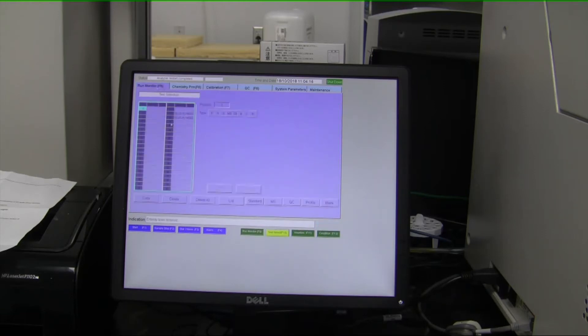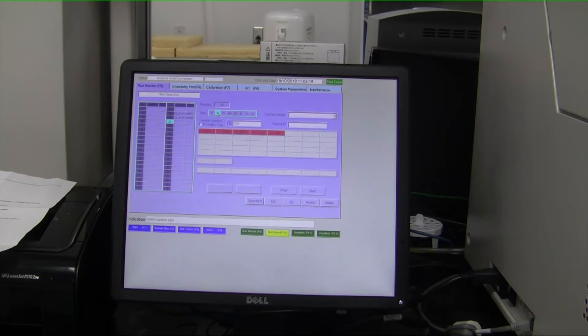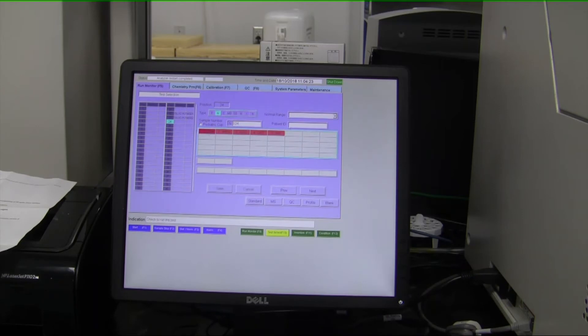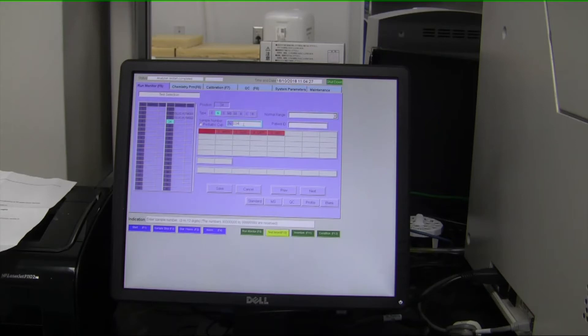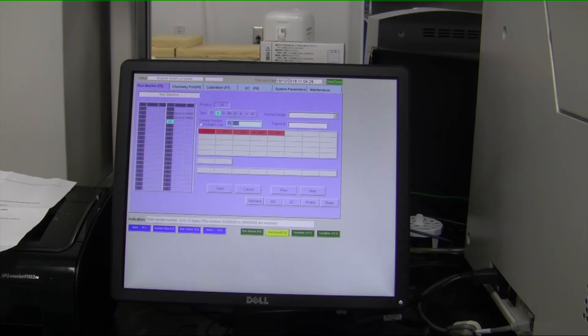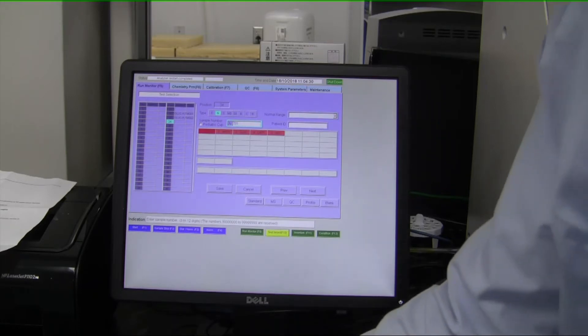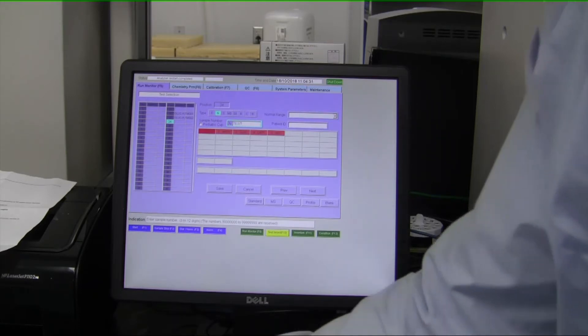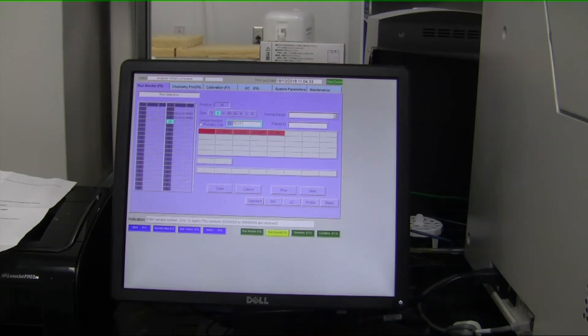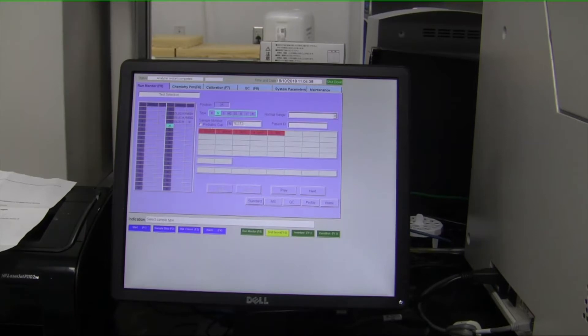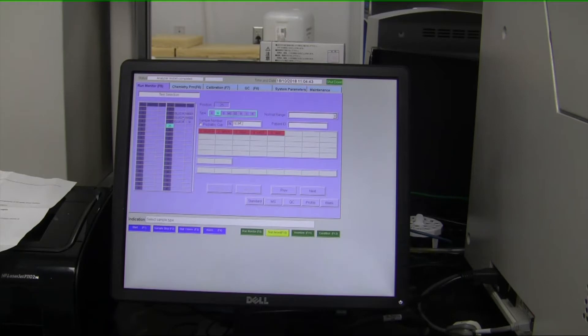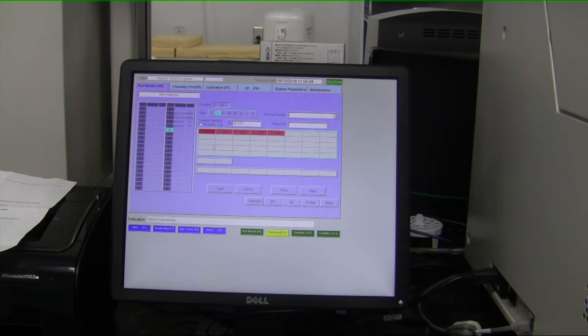Once you have all that loaded, you can go to the next position. Let's say, for example, we wanted to run a normal sample type and we wanted to run it for glucose. Here we can name the sample—let's just say we wanted to name it test one. Then when you save the position, you can see it automatically goes to the next position and it's ready for you to load the next sample and automatically increases the last digit from one to two. So it sequentially names the sample, and then you would just have to select your metabolites and click save. So it's essentially two buttons to run the samples.